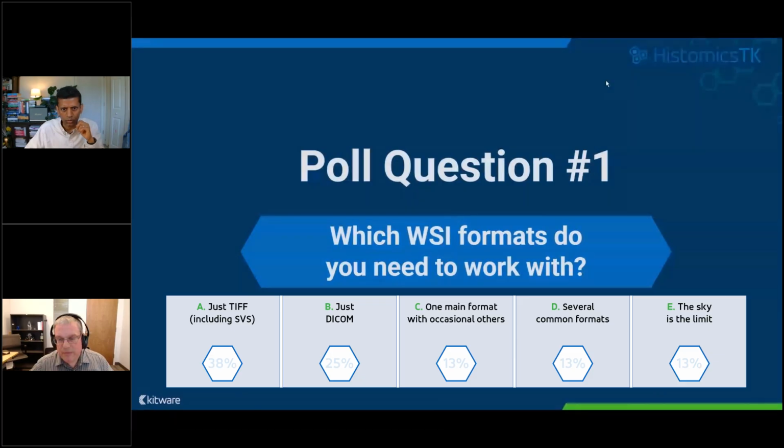I'm not seeing the results now because the poll has ended, but I saw that mostly TIFF and SVS was the top choice. Yeah, I suppose that's not surprising. Aperio was sort of the first to market to have FDA approval for doing this. So they're sort of the de facto winner at the moment.